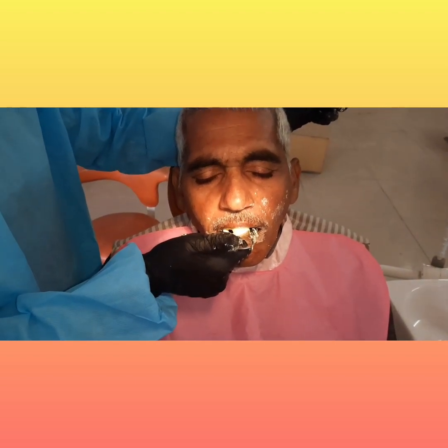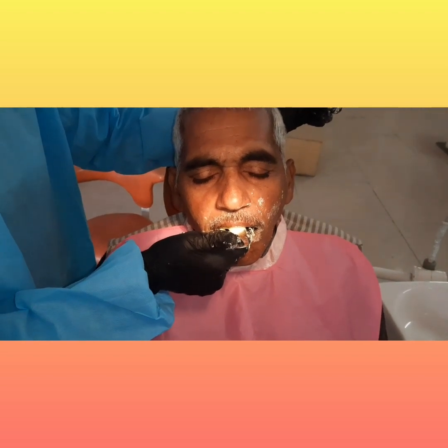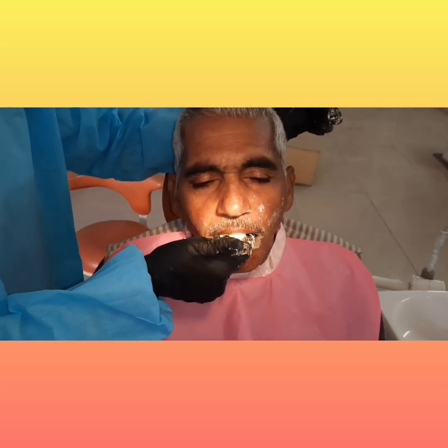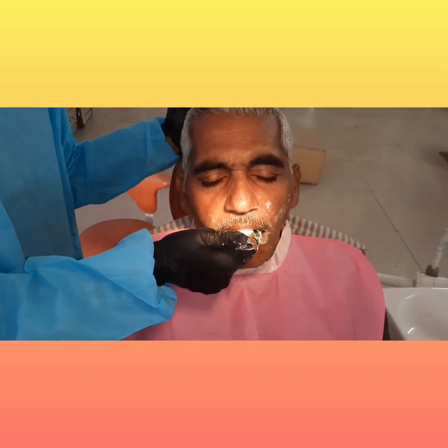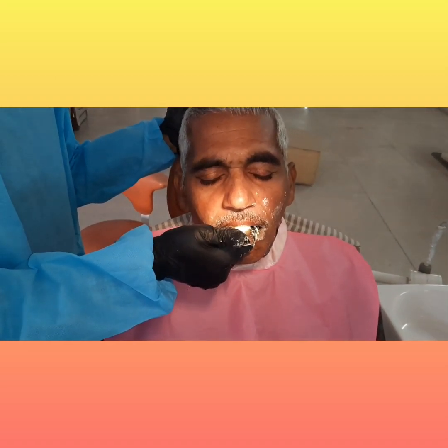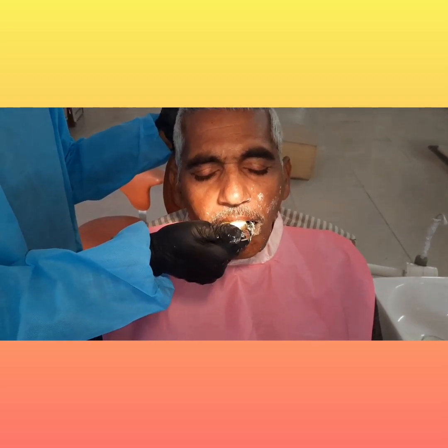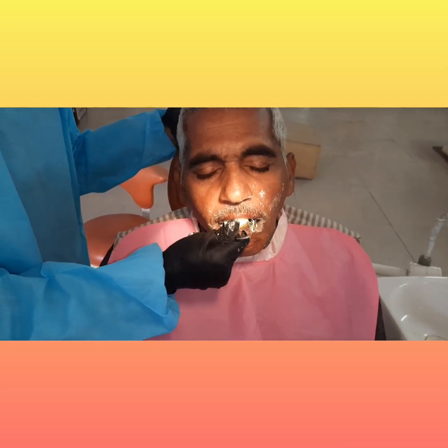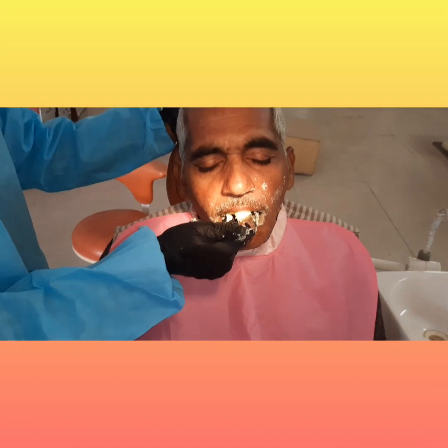Once you have both impressions, you can disinfect them in 2% glutaraldehyde. You can also use iodophors for disinfecting, after washing the impression first. Then pour it with the appropriate gypsum product — mostly for a primary impression you use Type 3 gypsum product, that is dental stone, for making study casts, study models, and your primary cast.